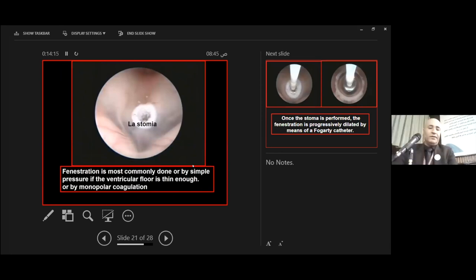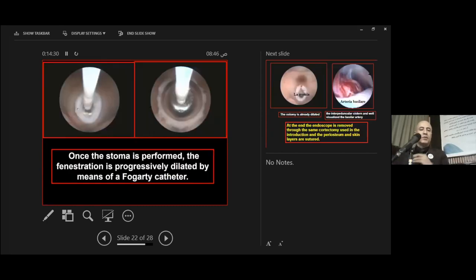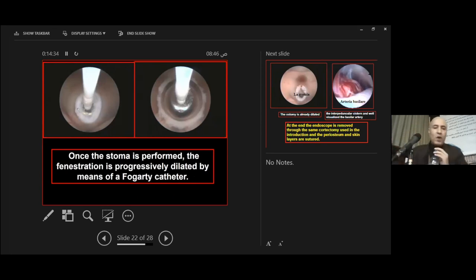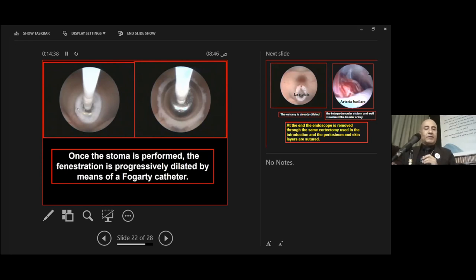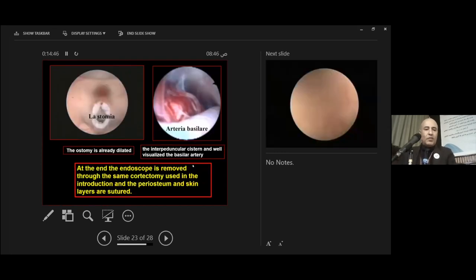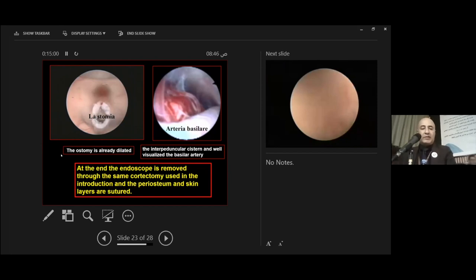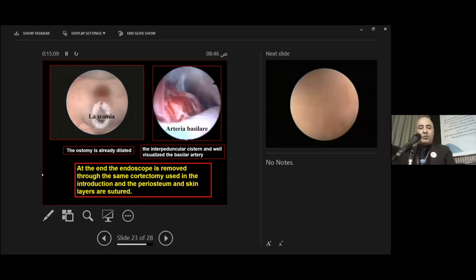This is the stomy. Fenestration is most commonly done by simple pressure on the ventricle floor or by monopolar coagulation. Once the stomy has been performed, the fenestration is progressively dilated by means of a Fogarty catheter. The stomy is already dilated here. The pre-pontine cistern is visualized, and we can see the basilar artery at the end. Then the endoscope is removed through the same corticotomy used for introduction, and the burr hole and skin layers are sutured.